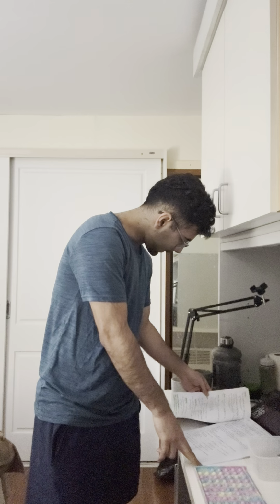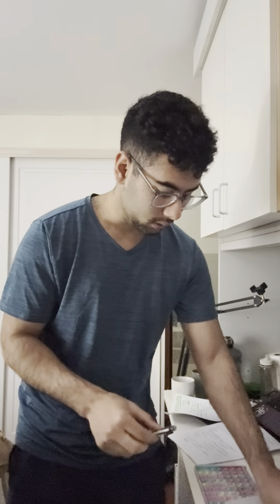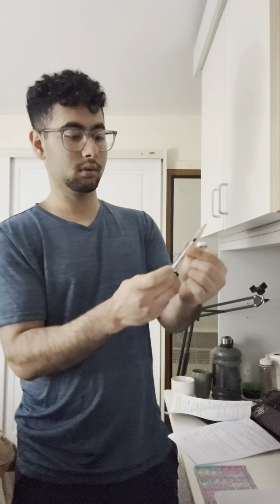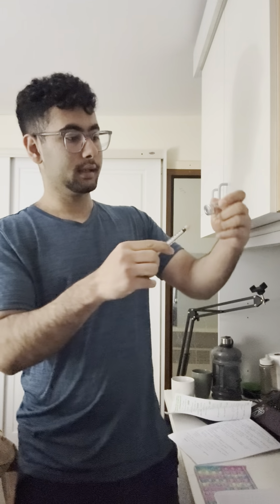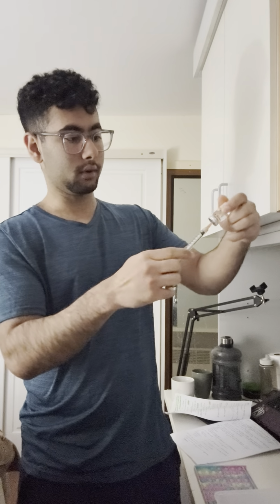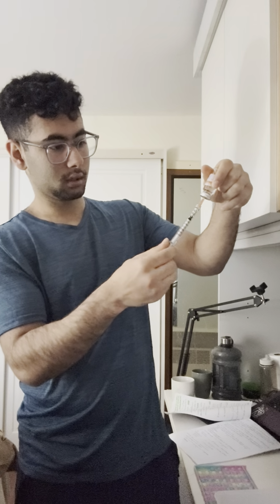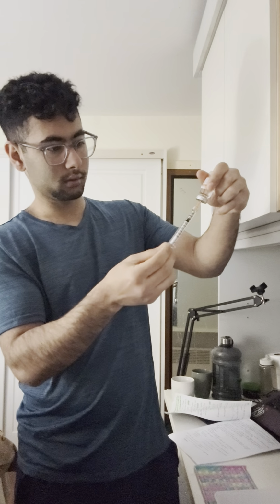And in the third check, before the third check, in the second check I will draw the insulin from the vial, right? So I will wipe this cap using the alcohol swab, take it out, and then I'm going to draw it up. I'm going to draw how much I need. I need 4 units for this case. So I'm going to draw 4 units.